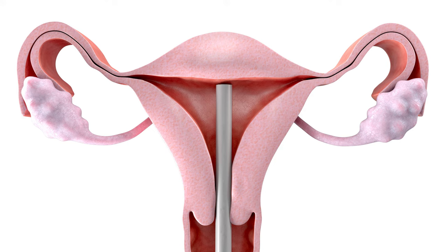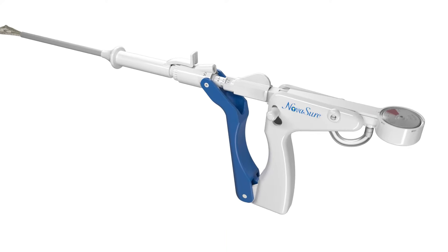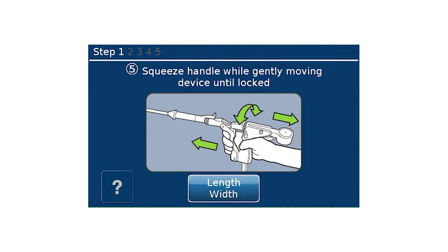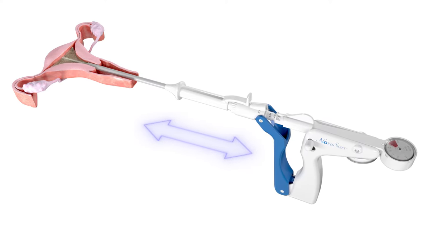Withdraw the device approximately 0.5 centimeters from the fundus while slowly squeezing the handles without locking the device, up to the point of increased resistance. Continue to slowly squeeze the device handles together while gently moving the device about a half centimeter to and from the fundus.